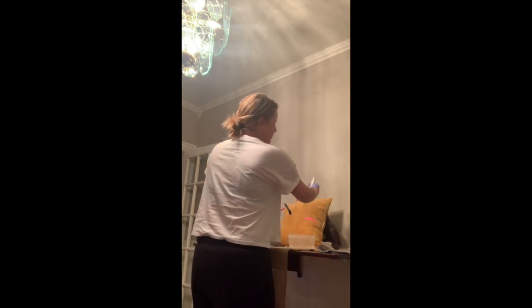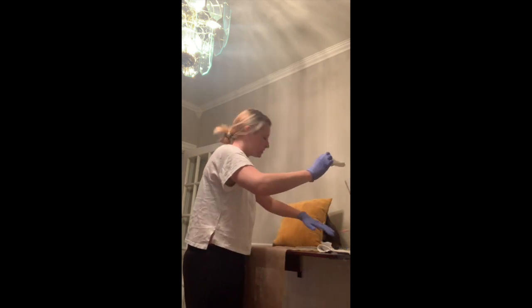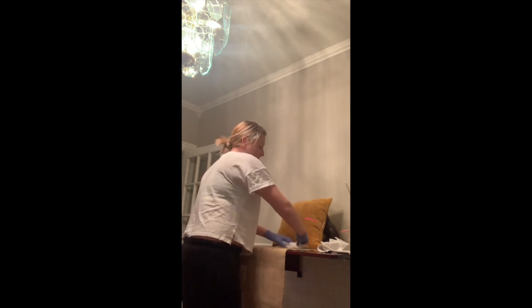We're going to say that we administered as much of that enema as they can handle. I have the clamp back on because there's still some left. When I pulled the enema out, I wrapped a paper towel around it so that way we don't get it everywhere, and set that off to the side. I'm going to pull out the pad and throw it in the trash, and roll my patient back onto their back. I'm going to make sure I informed the patient that I would like them to hold their bowels for the next five to 15 minutes, just so that enema has time to work.